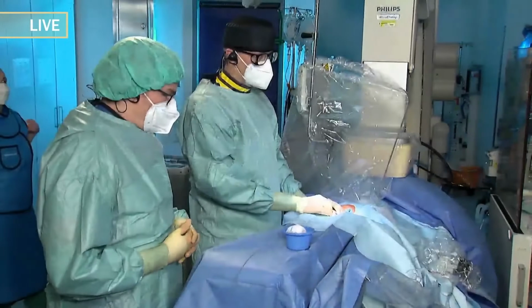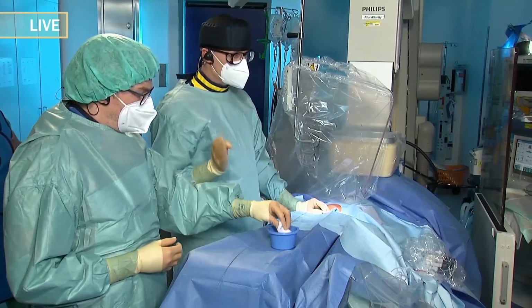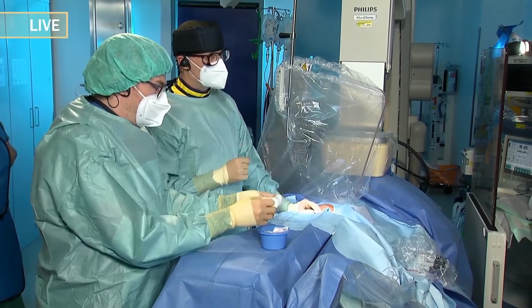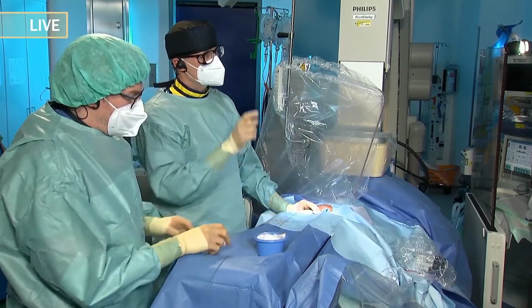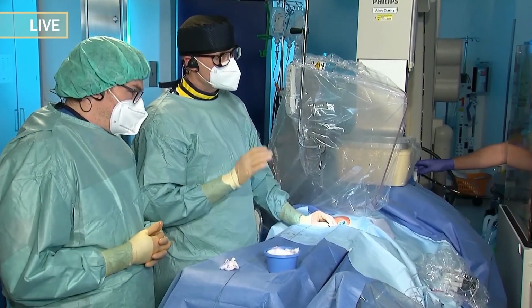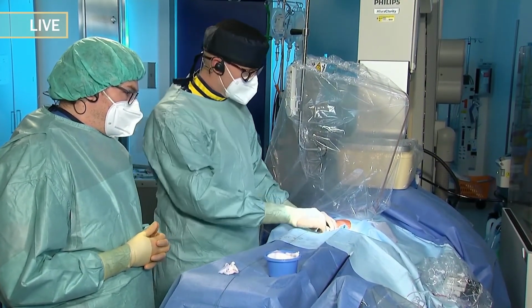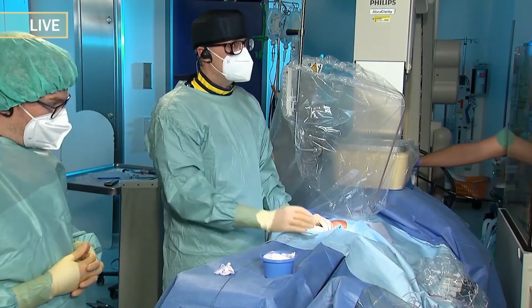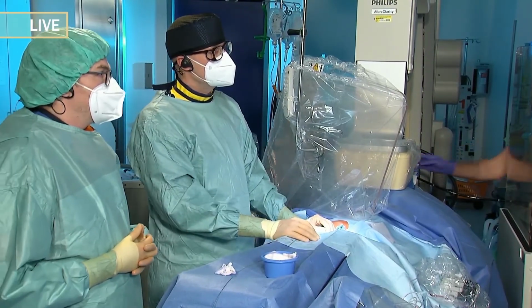Okay, so we will go on with our case. So this is really a challenging case. As you see, the imaging in this amyloidosis patient is quite difficult with the thickening of the septum. So we will see how it goes. So first thing, I don't know if the panel wants to discuss a potential strategy. Yes. We will now go on with the case.